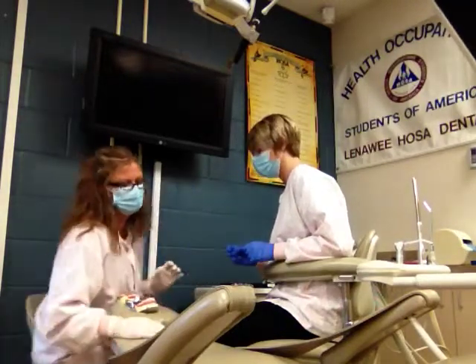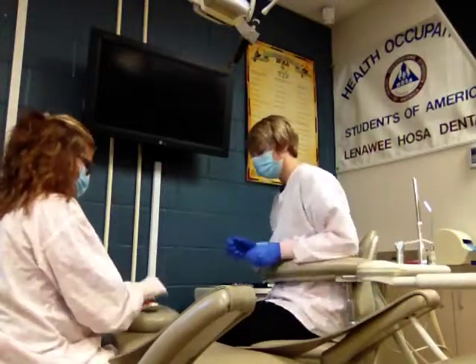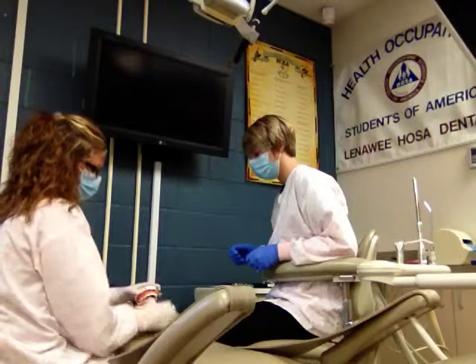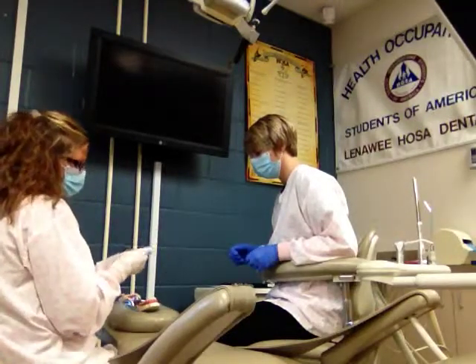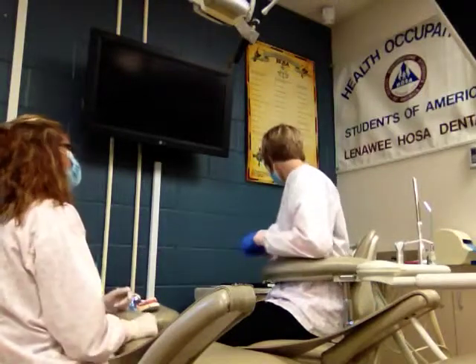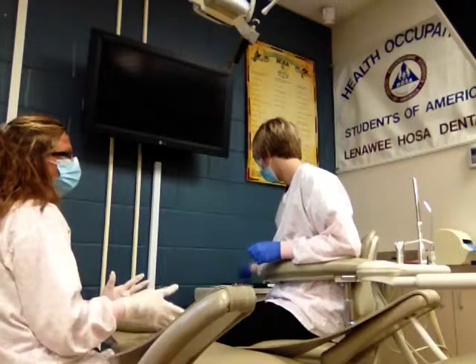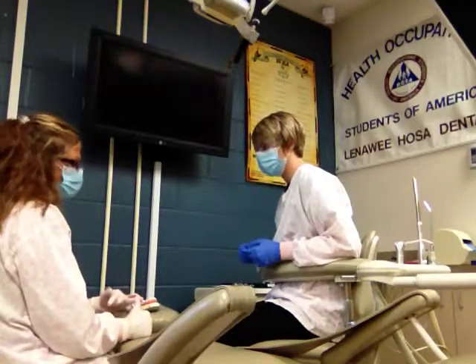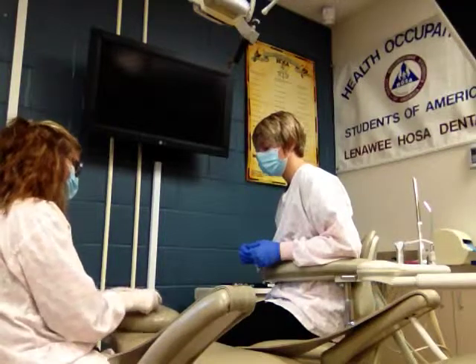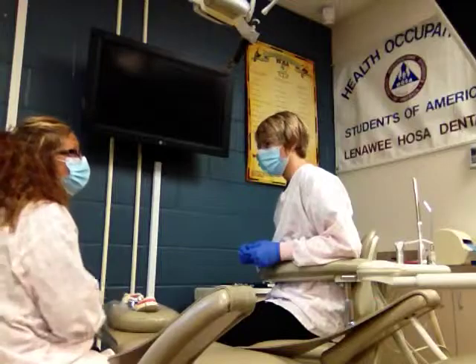Now at this point we're going to go ahead and put the gauze in their mouth, fold it in half and in half again, and let them bite down. In this case you might need more than one. You certainly change it before the patient leaves. And if they've had IV sedation, we tell the parent or whoever brought them the same instructions about no smoking for 48 hours, no spitting or sucking out of a straw. Those would all cause a dry socket. So that is surgery number 3 for skills.